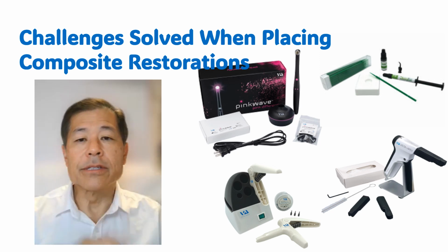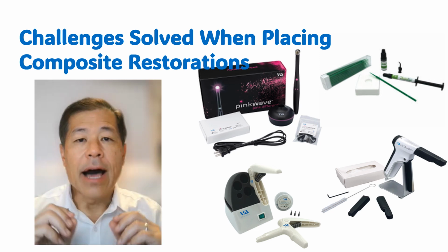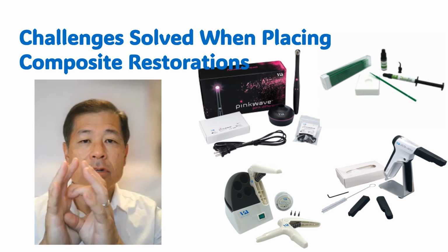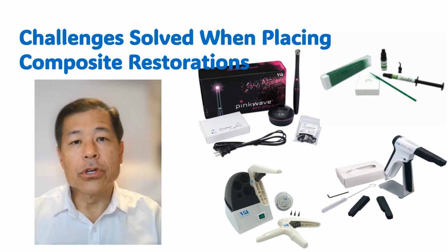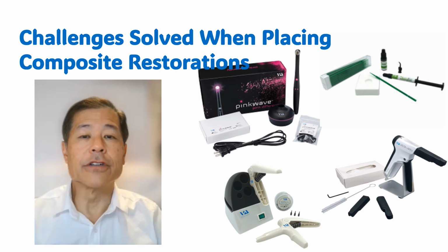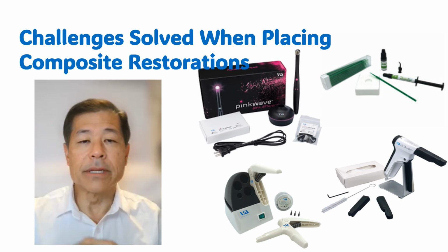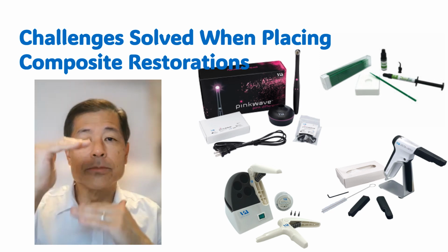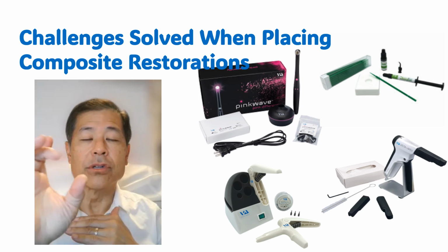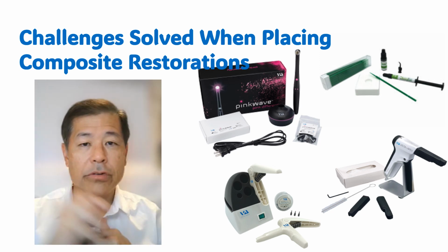Above this over here, you see the pink wave curing light. Now that is a 4 wavelength light, and it's a high intensity light with a very large lens, over 12 millimeters in diameter. So I want a light that will cure my composite completely to the proper depth of cure and do it fairly efficiently. So if I had a smaller lens, the circle that the light's emitted from, and I was doing a central incisor that maybe was 11 millimeters from gingiva to incisal edge, I might have to cure the gingival half and then cure the more incisal half and have a little bit of overlap in the middle.